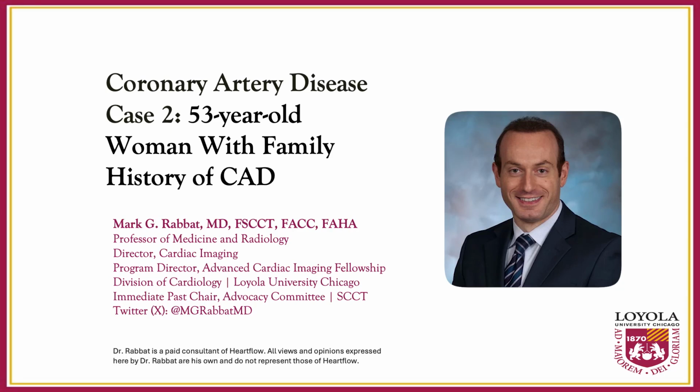I'm a professor of medicine and radiology and the director of cardiac imaging, as well as a program director of the Advanced Cardiac Imaging Fellowship at Loyola University in Chicago, and the immediate past chair of our advocacy committee of the Society of Cardiovascular CT. Today, I would like to present three different cases on utilizing CCTA and Heartflow's AI to inform coronary artery disease diagnosis and management.